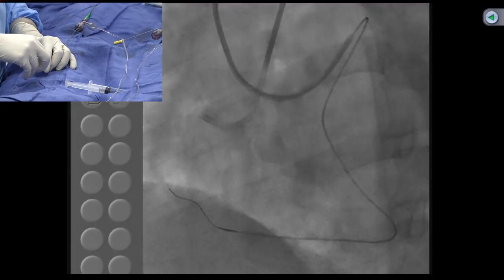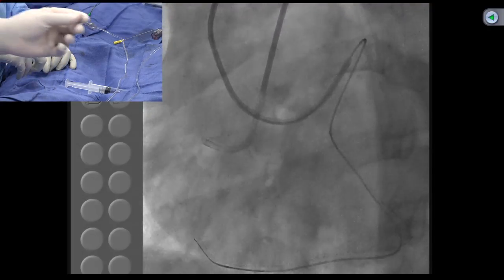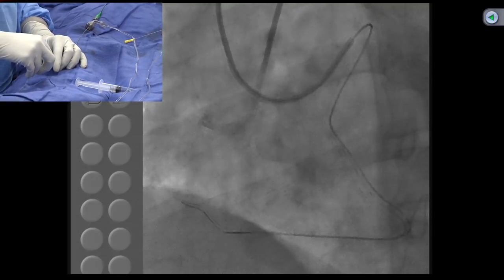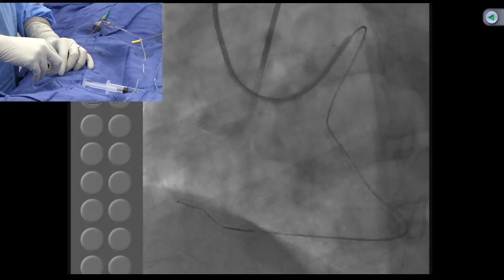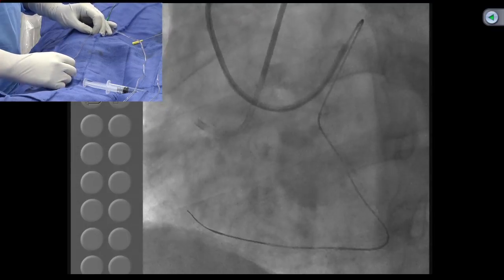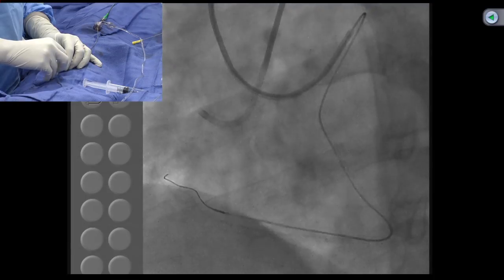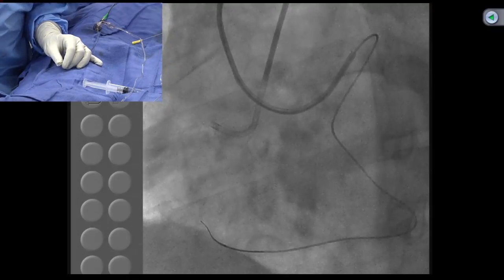In any situation, are you getting a cardiac MRI to demonstrate viability sometimes? Viability, of course. In any case, when you try a CTO recanalization, you better be sure that it's viable and ischemic, both. But a lot of people actually use the CT angio to look into the course of the vessel, the retrograde vessel. And secondly, if it's a very large plaque burden, which has been associated with distal embolization, then avoid the CTO.